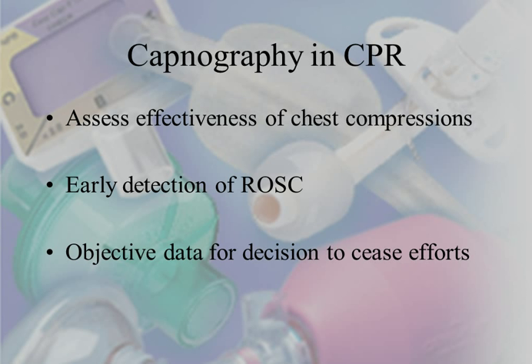All right, so capnography and CPR, remember, it assesses the effectiveness of our chest compressions. No matter how big and burly and strong you are, they say that if you don't change chest compressors within about every 1 to 2 minutes, you will actually go down in your chest compression depth and quality. And this will tell you whether you're doing effective chest compressions or not. Definitely an early detection of return of spontaneous circulation, and objective data for the decision to cease efforts. So all of that information collected together gives us a good indication.